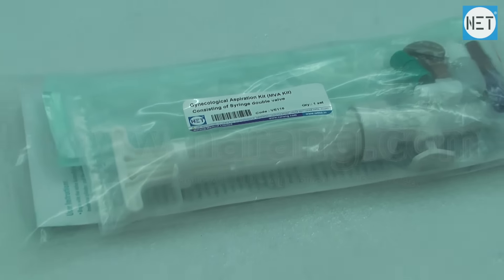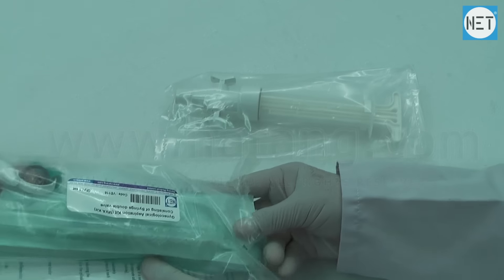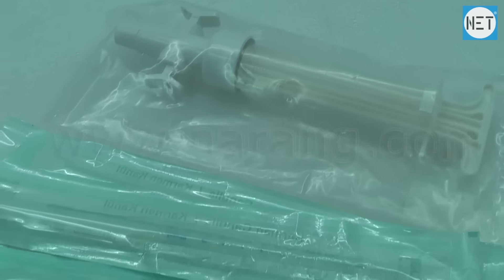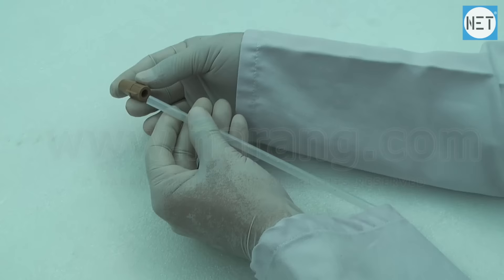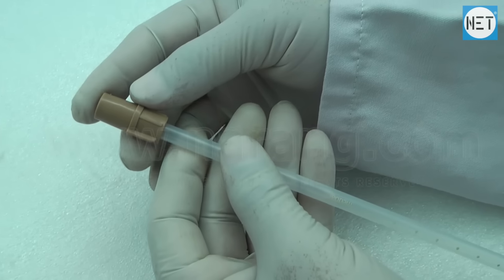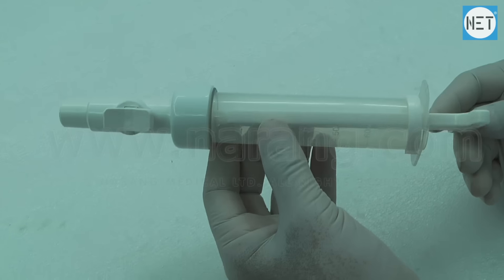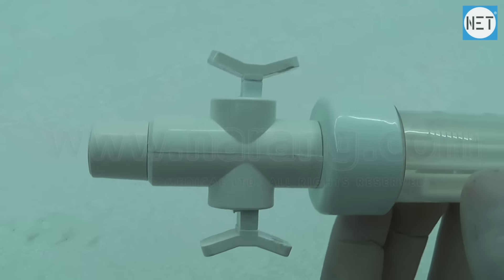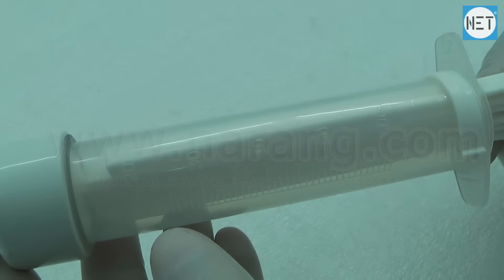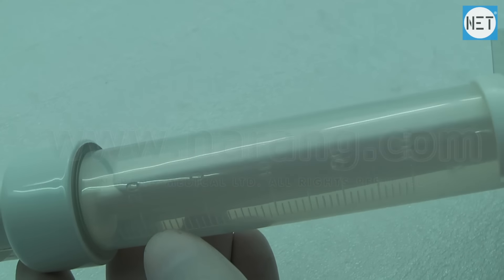Net Gynecological Aspiration Kit, also known as MVA Kit. The kit consists of a handheld 60cc syringe or aspirator with double valve, a set of 8 pieces cannula, a set of 7 adapters, and a lubricating oil. This kit facilitates manual vacuum aspiration, which is a method of uterine evacuation that enables women with early pregnancy loss to be treated safely.